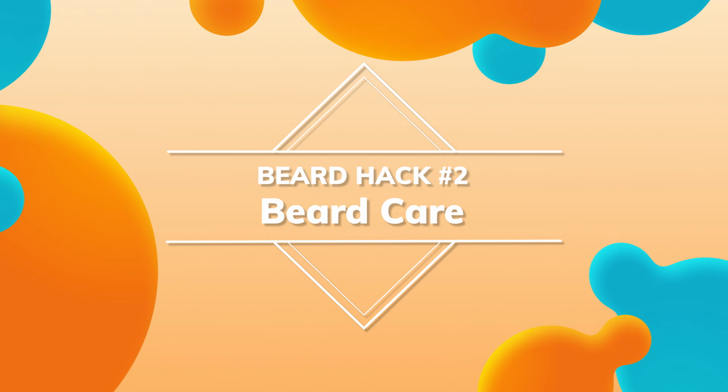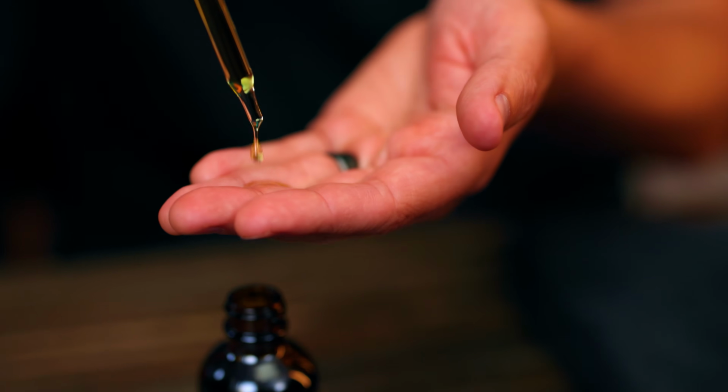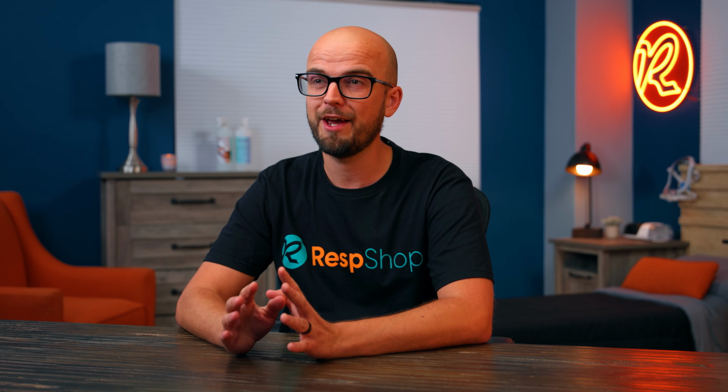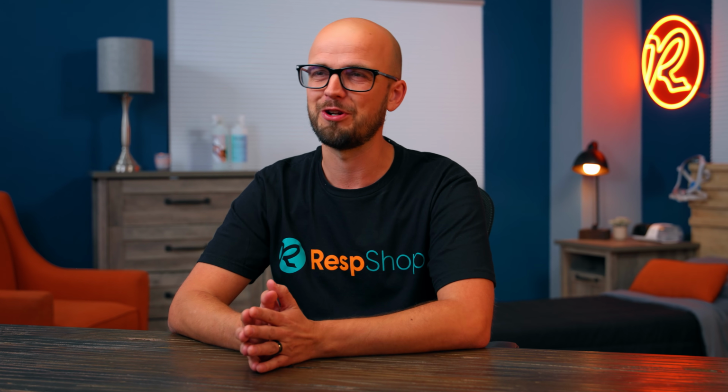Hack 2. The problem isn't just the presence of hair, it's the fact that facial hair tends to be thick, stiff, and wiry, which pushes against the silicone cushion as it tries to seal. So giving your beard a little TLC with some beard conditioner or oil an hour or so before bed can really soften those bristles and allow for a better seal. Now, of course, you'll want to wipe the oil away before you actually sleep, or you will create the opposite problem of too much slippage. We want soft, supple facial hair so that you can get a good night's sleep and have that fantastic beard too. What's not to like?